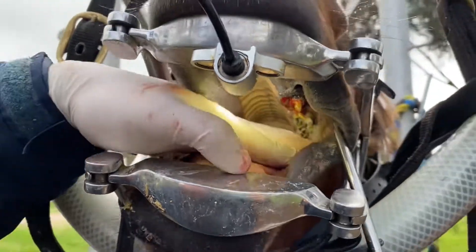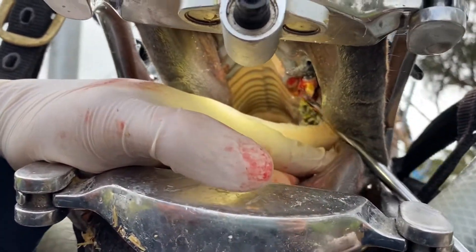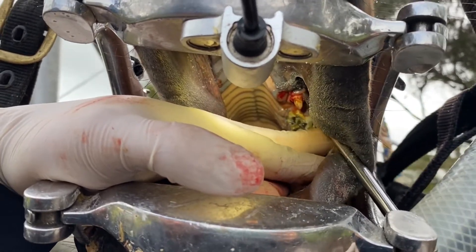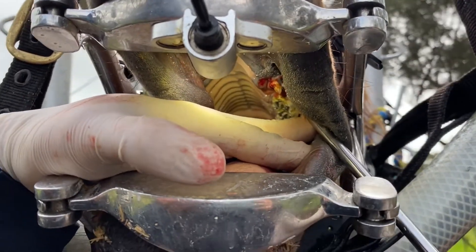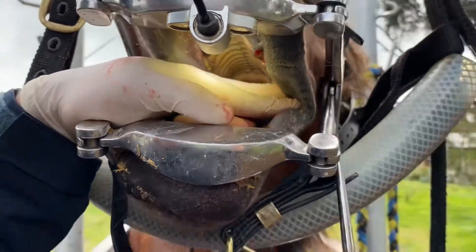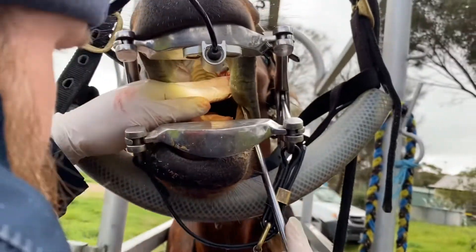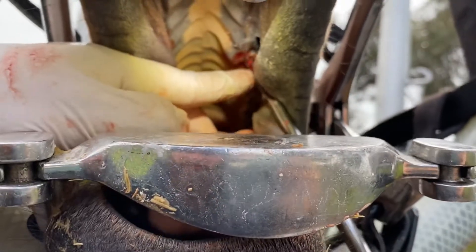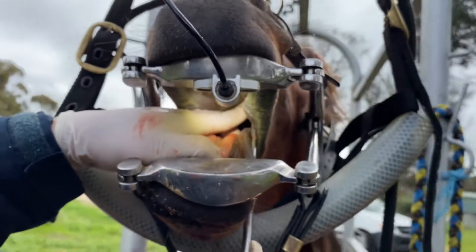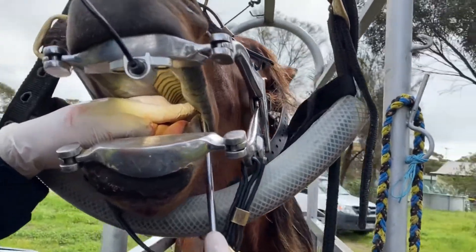We've already done a nerve block — that's why it looks a little gnarly in here — and this horse is not feeling it. What we're doing is working our periosteal elevators or wolf tooth elevators around the outside of this tooth to relieve the mucogingival junction, then take off the periodontal ligament to allow us to loosen this tooth and remove it. We're still just elevating, going around the outside of it. You can see how big it is here inside the mouth. We're damaging the periodontal ligament and loosening the tooth, trying very carefully not to fracture it, because we don't want to leave a root inside the mouth, especially such a big one.